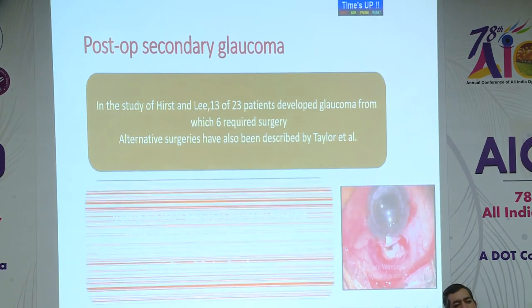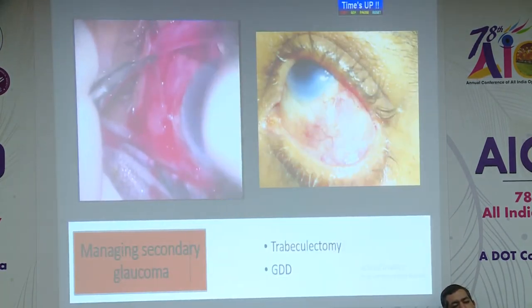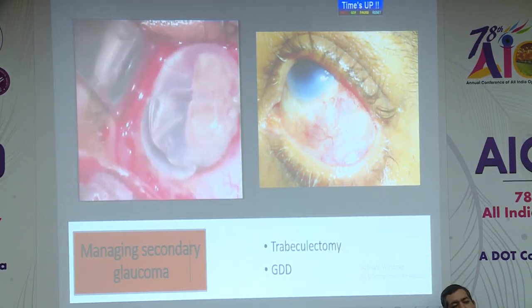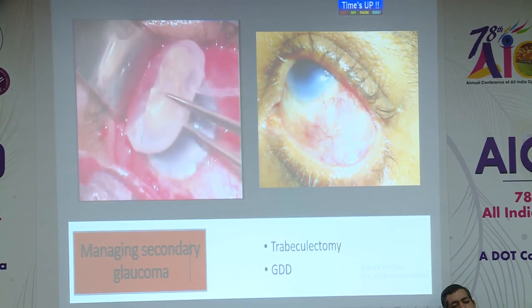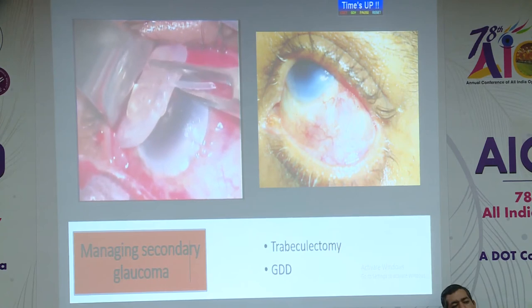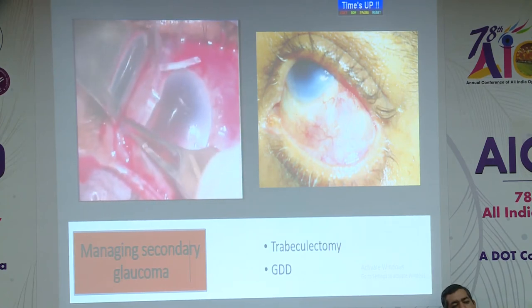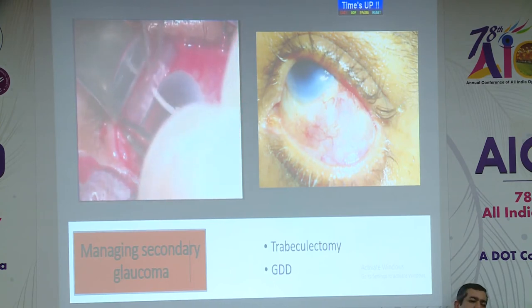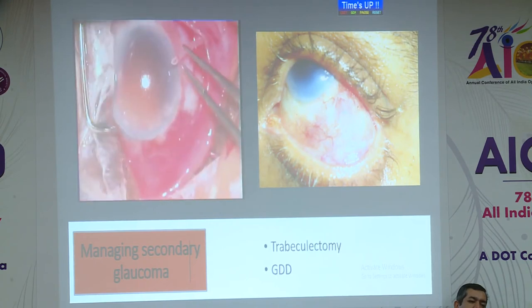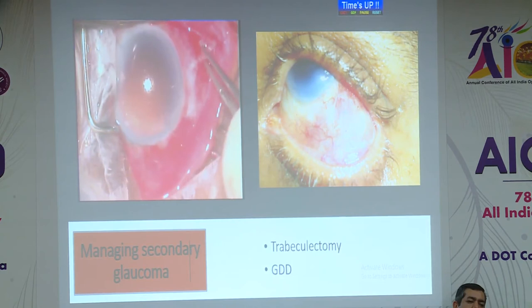Postoperative secondary glaucoma is seen in quite a high percentage, and this can be managed with trabeculectomy. In most of the cases, trabeculectomy doesn't work, so we have to go for a glaucoma drainage device. This case was a large anterior staphyloma, and while doing the keratoplasty, there was spontaneous extrusion of the lens iris diaphragm, and the patient became aniridic and aphakic. Trabeculectomy failed, and in this case, a glaucoma drainage device was placed in the inferotemporal quadrant, as the conjunctiva in the superior part was not healthy.